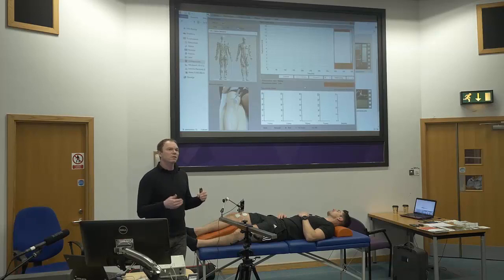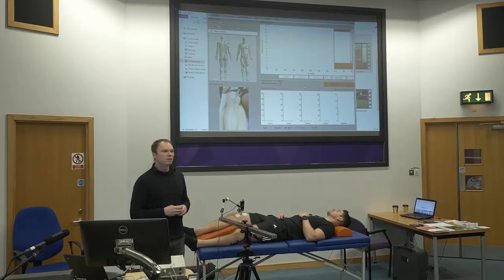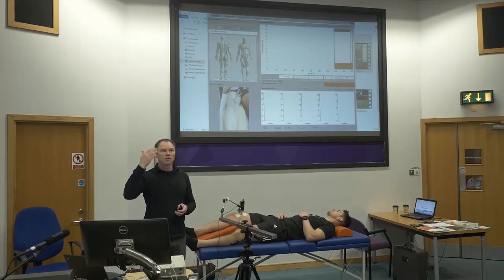Usually, if you start with 10 mA, you will get a flatline — you're beneath the threshold. So we start at 20, and then we gradually increase, usually by steps of 10 mA, until we get maximum response or until we get the supra-maximum stimulation.